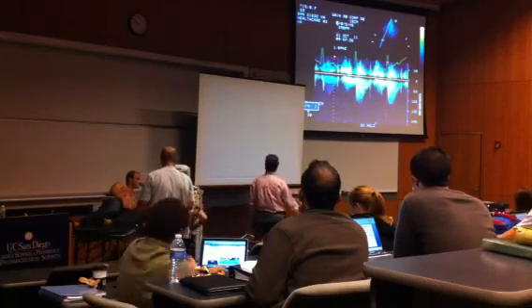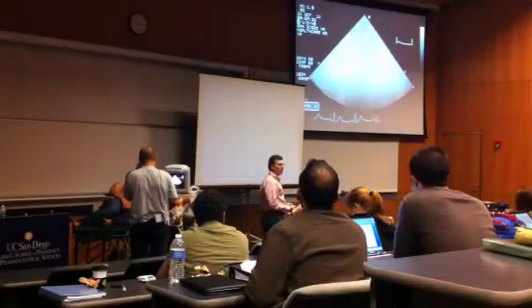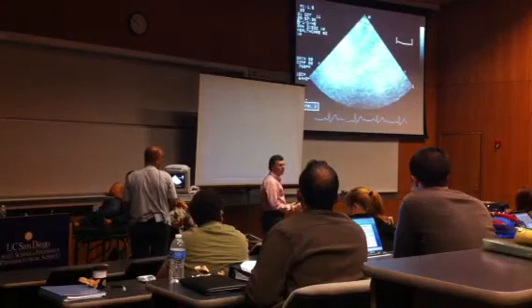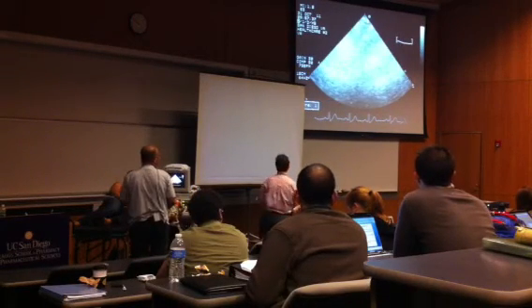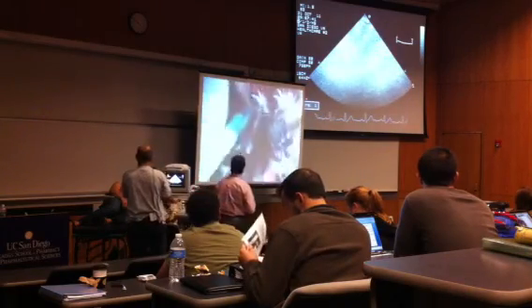As we're recording the ECG, we determine our heart rate, and having the heart rate and having our stroke volume allows us to calculate what? Cardiac output.